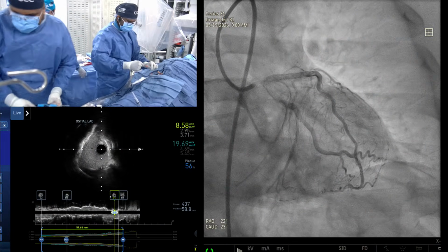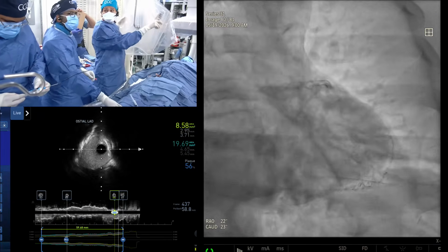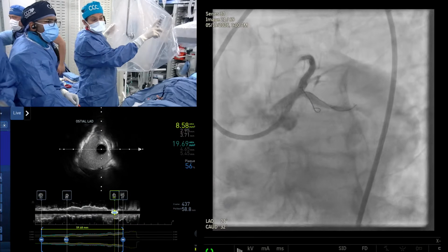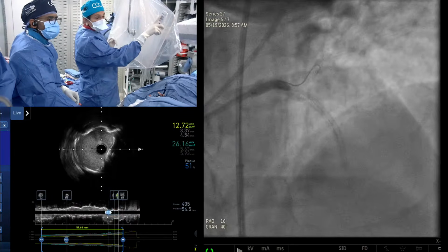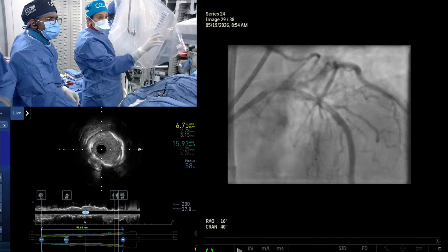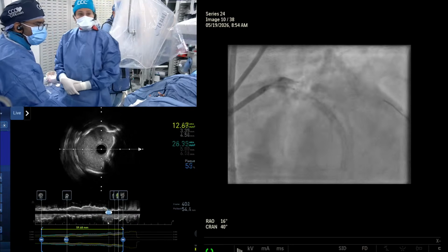Yeah, imaging guided PCI. Okay. Show that. That's the final picture you can see. Good, very good. Absolutely pristine and outstanding. So we actually had a 48 that was not covering, so I just advanced it and did 2 stents, 48 and then we put a 12 millimeter 3.5 and 4.0. We went up to 22 atmosphere.